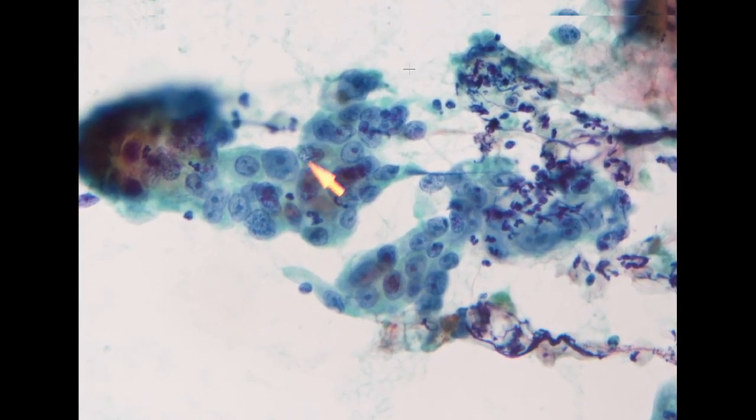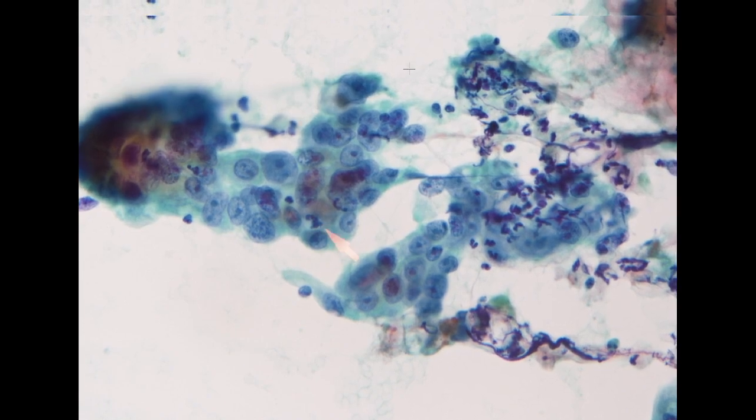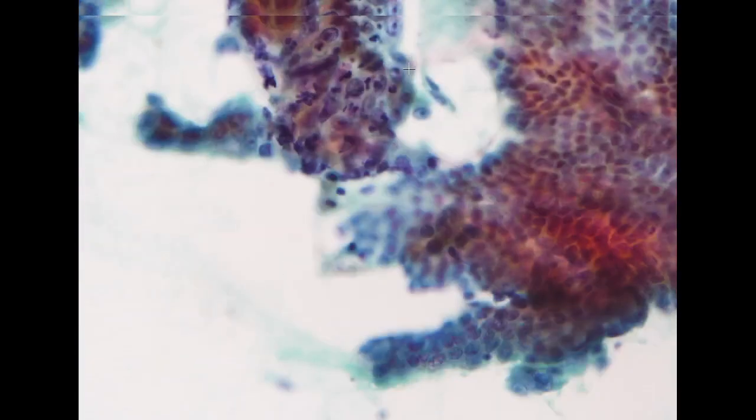In the same cluster, you have large variation in the size of the nuclei. Here we have some mitosis. So it is not difficult for us to make the diagnosis because we have this benign mucosa for comparison, just right adjacent to this focus.